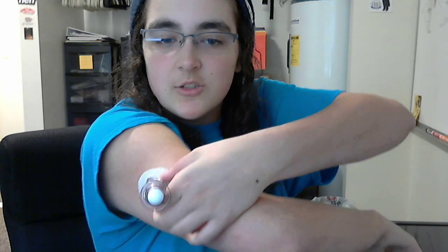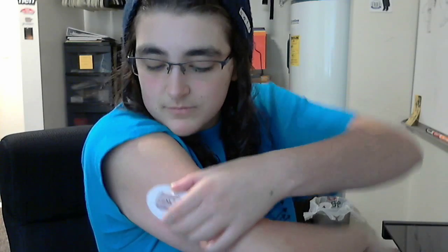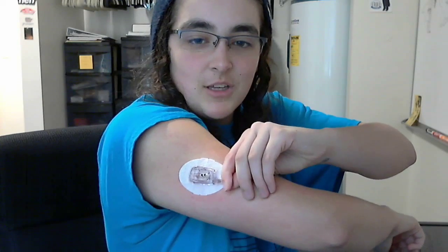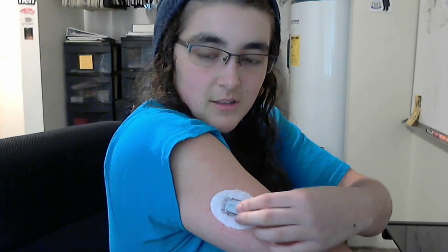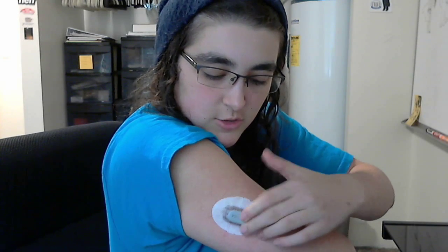You're able to just squeeze it and let it fall off. Then you can see the contacts for the transmitter. So normally, this thing is attached and you can use it to wedge the transmitter down. I'm going to have to do that myself. So I have my little thing, put it down and push it down till you hear 2 clicks. And now the sensor is in my arm.